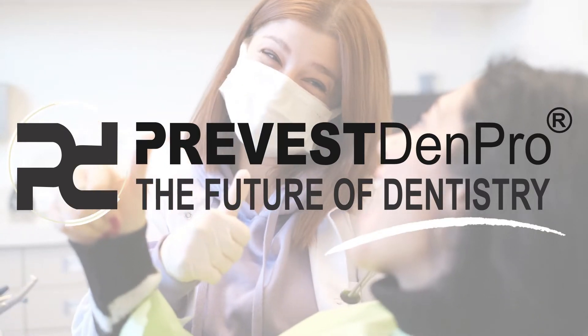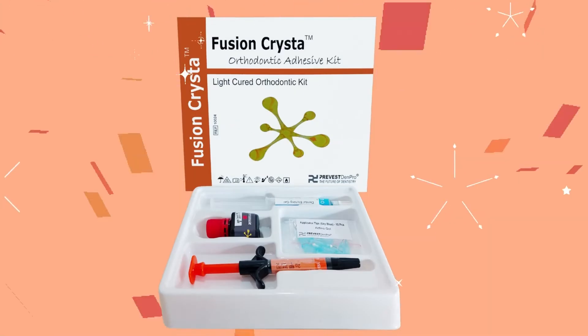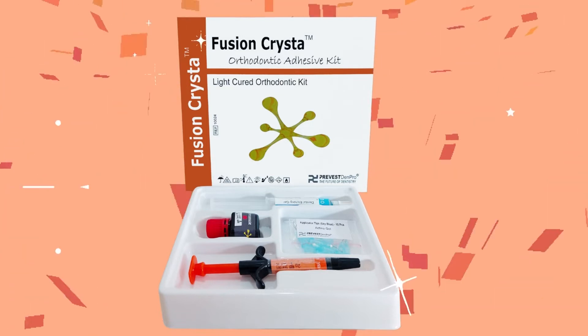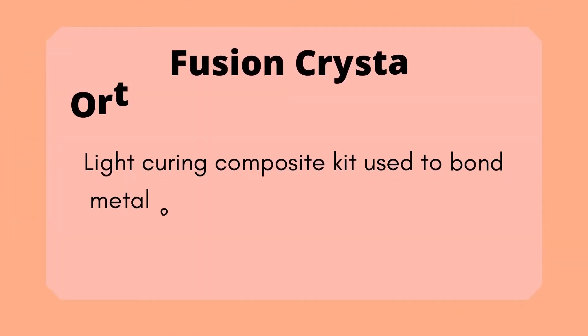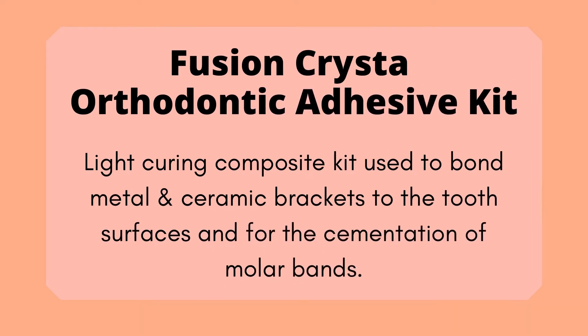Prevest Denpro presents Fusion Crysta Orthodontic Adhesive Kit. It is a light-curing composite kit used to bond metal and ceramic brackets to the tooth surfaces and for the cementation of molar bands.